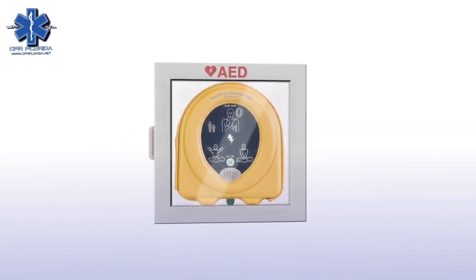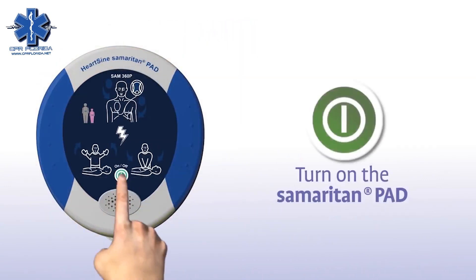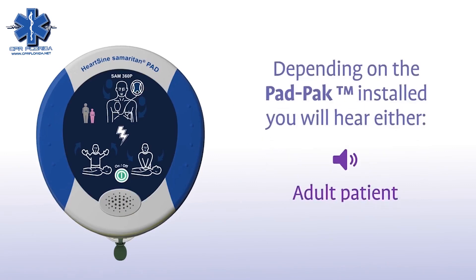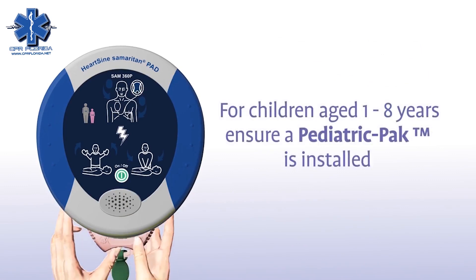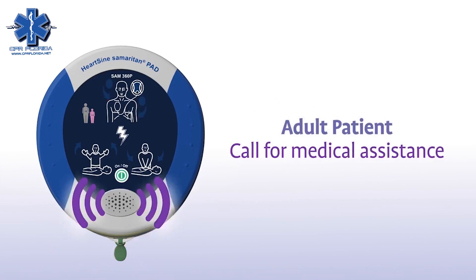Get the Samaritan PAD as quickly as possible and press the green on/off button to turn it on. Depending on the pad pack currently installed, you will hear either an adult patient or a child patient prompt. If the patient is a child between one and eight years of age, ensure a pink pediatric pack is installed; if not available, use the gray adult pad pack instead. Adult patient — call for medical assistance.